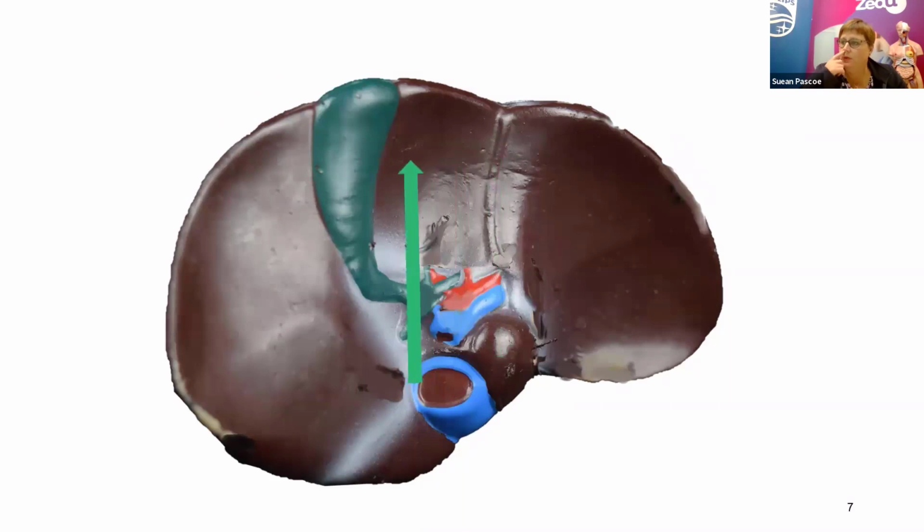So essentially what I'm doing is starting midline, transversing to where I see the portal vein enter the liver. I then hold the top of my probe still and pivot the bottom bit until I lengthen out the portal vein and the bile duct. Then I tilt the probe a little bit, just a squeak towards the patient's head. So we slide from the patient's midline, rotate the probe, and then tilt the probe up ever so slightly.